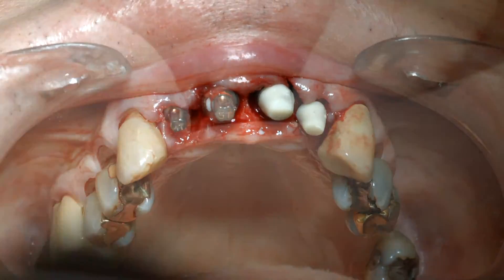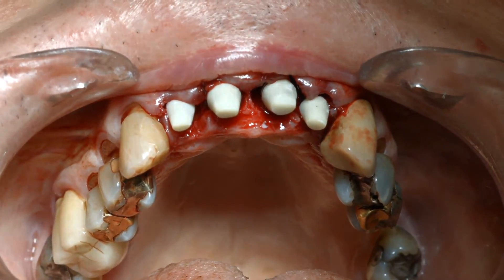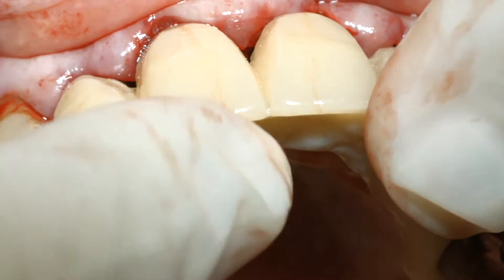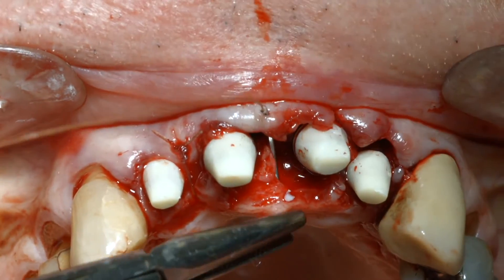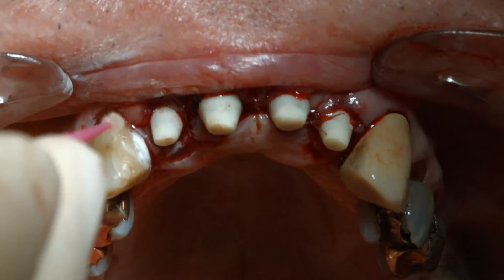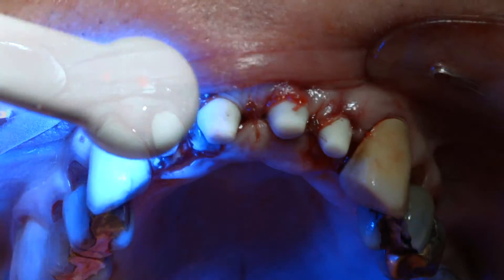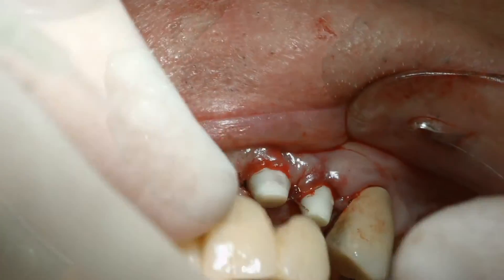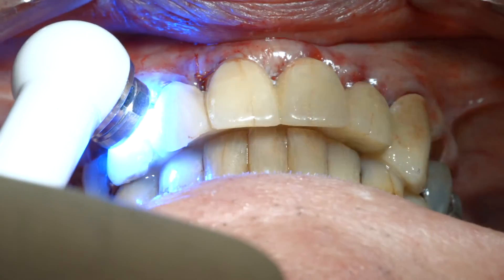Once the modified temporization sleeves were seated onto the universal abutments, the adaptation of the TRINIA stabilizing prosthesis was confirmed for a second time prior to placing harvested bone around the abutments and suturing the mucosa. After suturing, the adjacent surfaces of the natural teeth were prepared for bonding, and the transitional stabilizing prosthesis was cemented with a resin cement onto the modified temporization sleeves and bonded to the prepared palatal surface of the adjacent teeth.